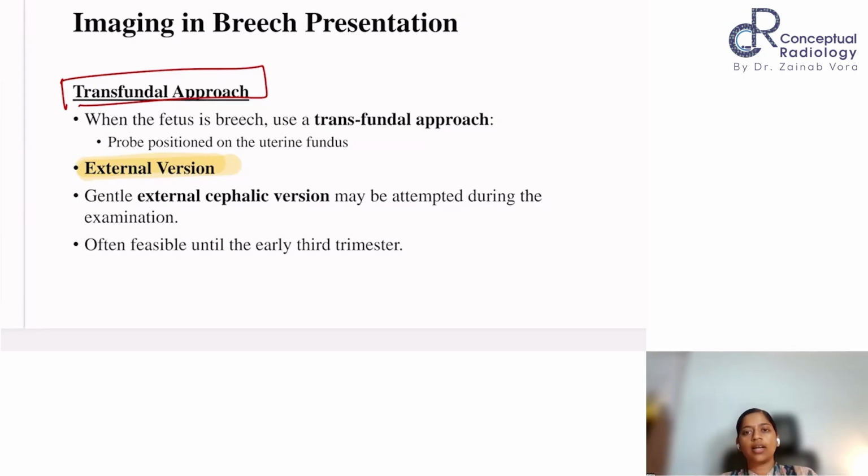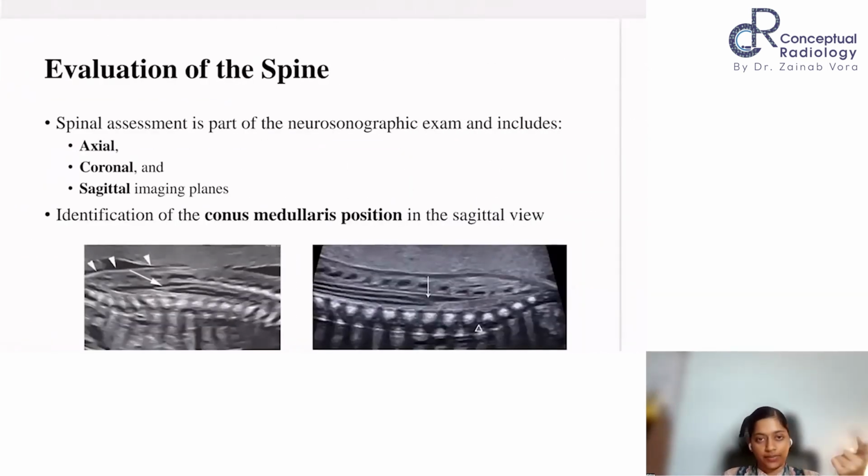So you will understand how you will shift from axial to sagittal plane. Shifting between sagittal and coronal is relatively easy, but axial to sagittal is a little difficult because the same thing will not happen at the same place. You will have to move your probe to the other side of the abdomen. That's very nicely displayed in that video. But when we finish everything, in the end, we will summarize it in the next lecture.